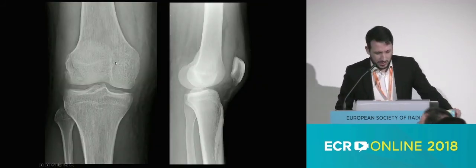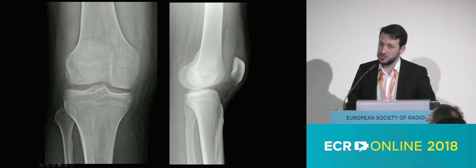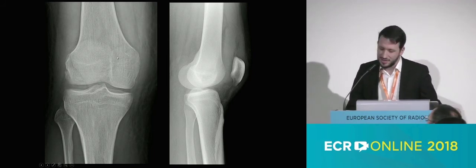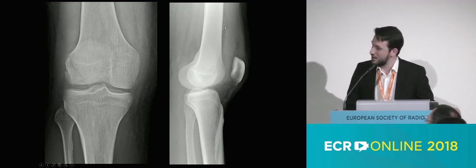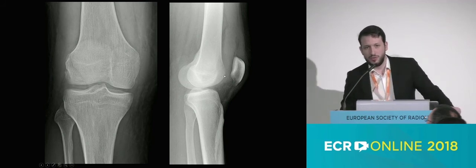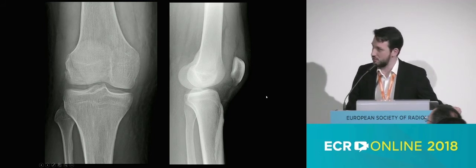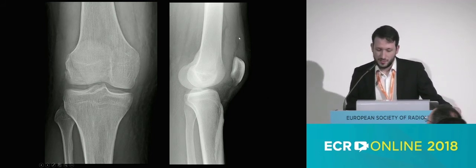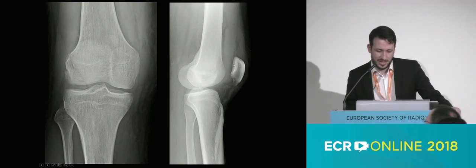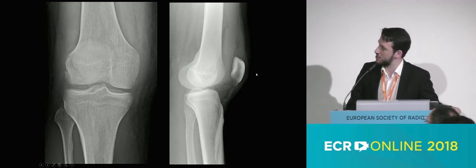And last but not least, this patient, I think she was 16, came for a knee trauma, and as usual, you don't really know what happened. It was just a trauma, and you do the X-ray, there's nothing special except this big intra-articular fluid. Most of these patients, we don't perform cross-sectional imaging, except when there is a lipohemarthrosis that may let you think there is a fracture, but this wasn't the case here. So this patient may have gone directly to the MRI 2 or 3 weeks later, which is common in France.